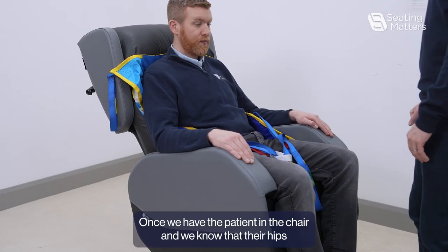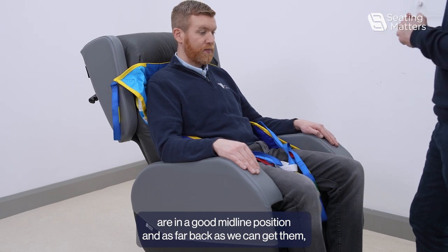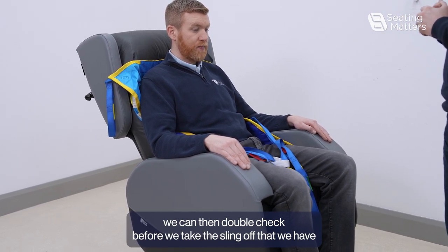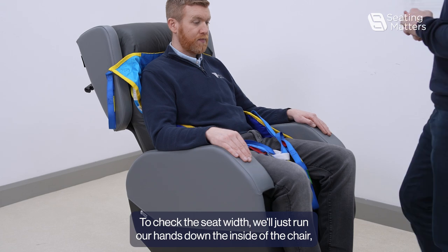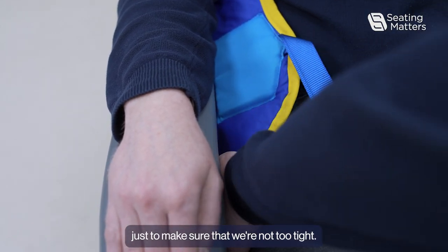Once we have the patient in the chair and we know that their hips are in a good midline position and as far back as we can get them, we can then double check before we take the sling off that we have the seat depth right, the seat width right, and the footrest height right. To check the seat width, we'll just run our hands down the inside of the chair just to make sure that we're not too tight.